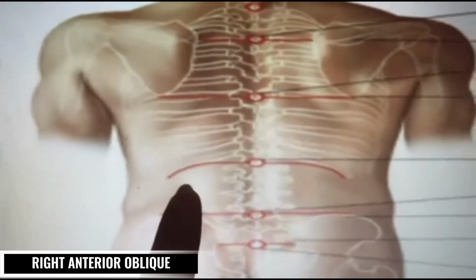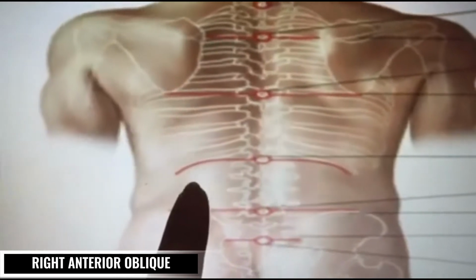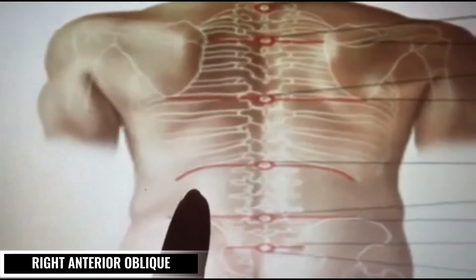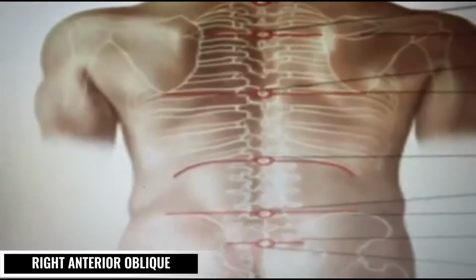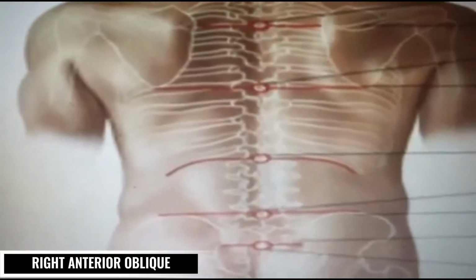Lastly is the hypersthenic type. Hypersthenic body organs are more transverse, so the central ray is about 2 inches above the L1, nearer to the midline.